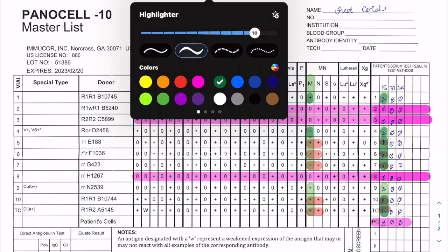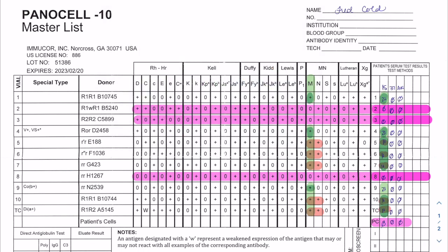And then we'll change this again. We have a homozygous cell, and we have a 2+ reaction. So you can see that dosage there with that anti-M. So there's your second example. This is just a cold antibody, and it is specific for, we'll put on here, anti-M.